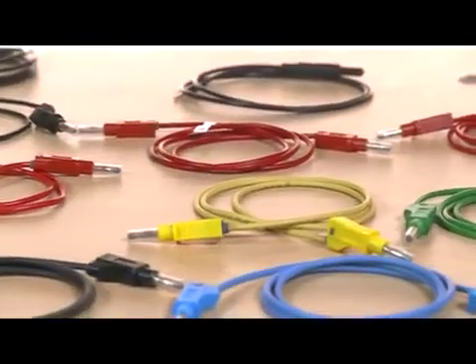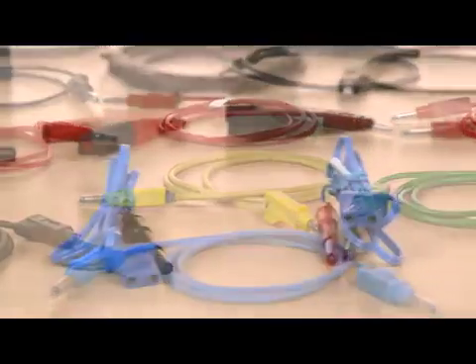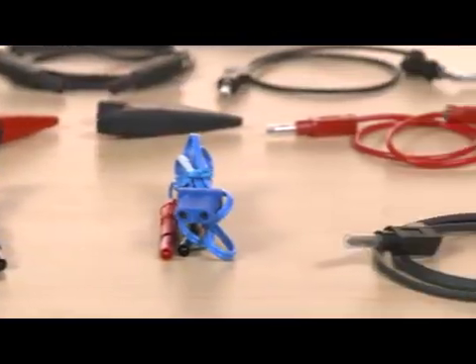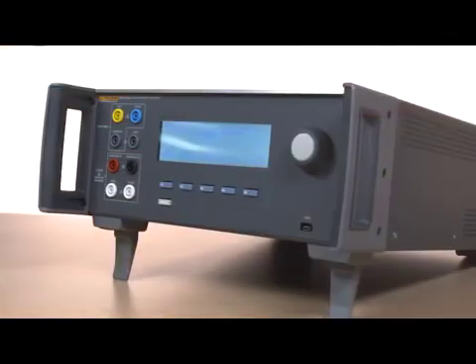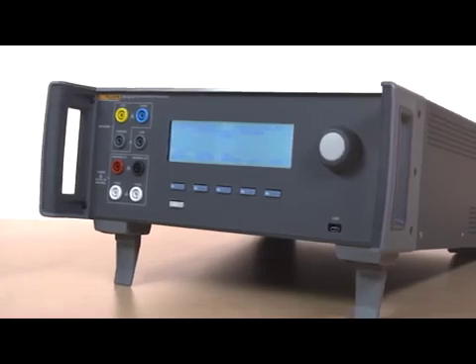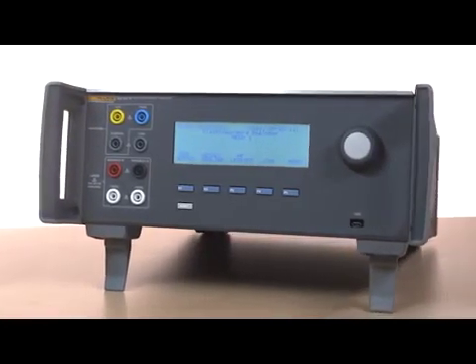Everything you need to test all critical functions of today's high-power electrosurgical units is either integrated into the design or included with the unit. There's no need for extra cables, leads, or switch boxes to test precision power, current, frequency, crest factor, and load resistance ranges.